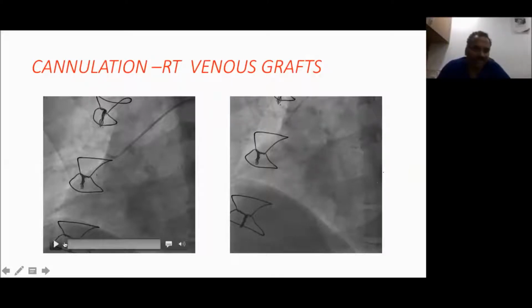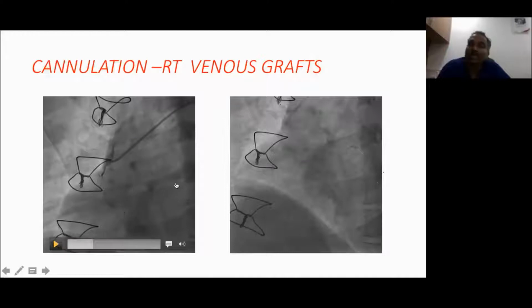And coming to the catheter, you can see this is a right JR. In my opinion, when it comes to JR, because we have a practice of gas sterilized catheters, most often in a gas sterilized catheter the primary curve is straightened. In a new catheter, the primary curve is very acute. Because the primary curve is very acute, new catheters won't cannulate coaxially to the right coronary artery.